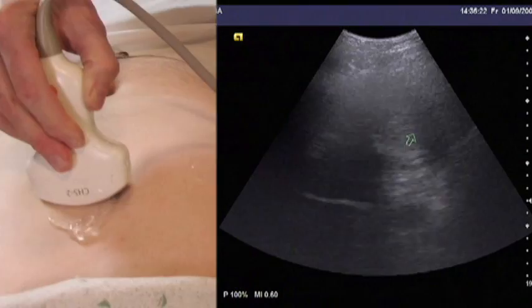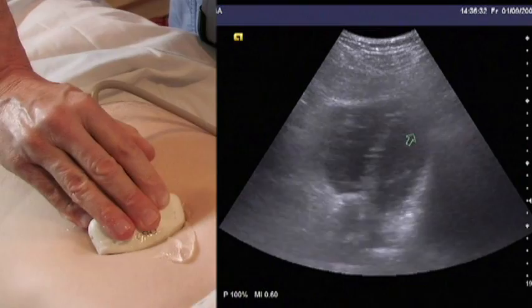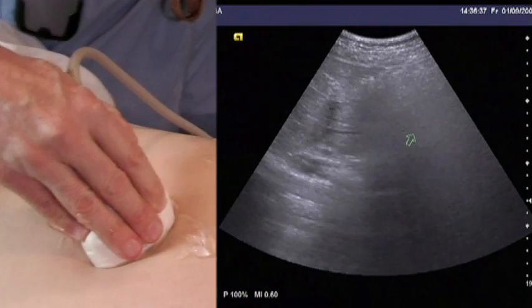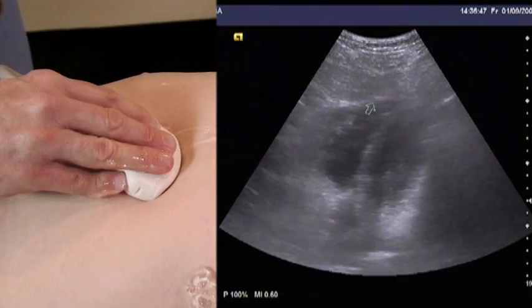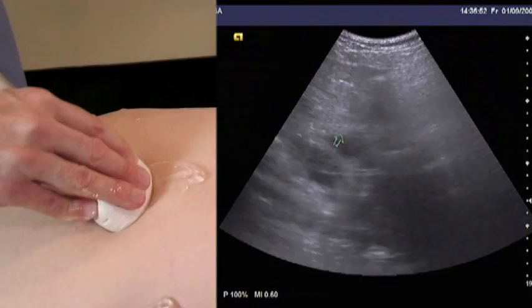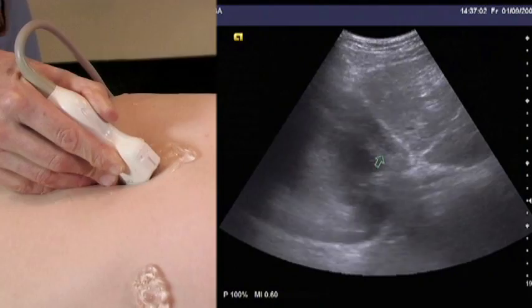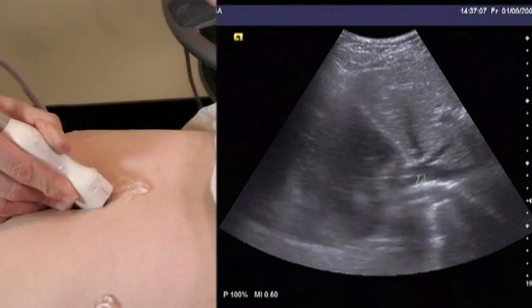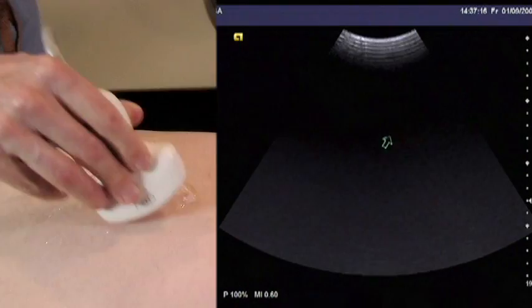In the subxiphoid area, we use the same technique as subxiphoid views of the heart — holding the probe mostly on top, pressing down firmly toward the floor, and scanning through all tissue planes from top to bottom. We're assessing the pericardial space for free fluid. This requires firm pressure with the probe nearly parallel to the floor since the heart is right behind the sternum. A longitudinal short-axis view of the heart in the subxiphoid region can also be used — many trauma surgeons prefer this. This view shows the IVC coming up, hepatic veins draining into the heart, and the pericardial sac, scanning the entire extent of the heart.